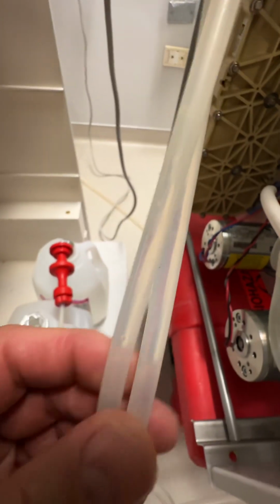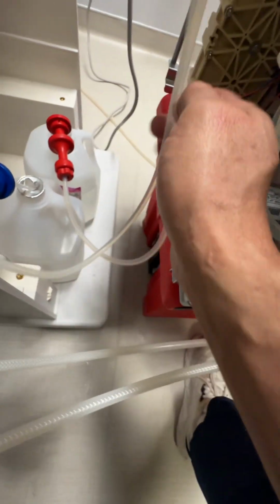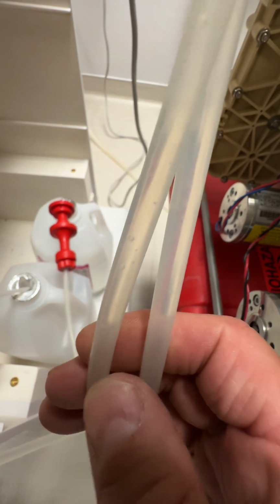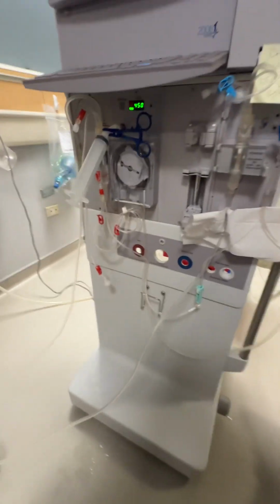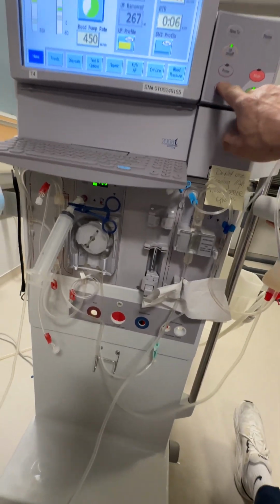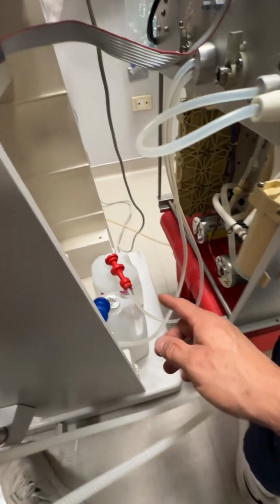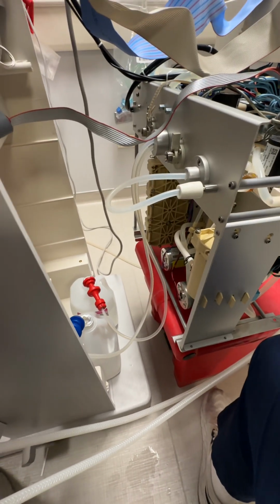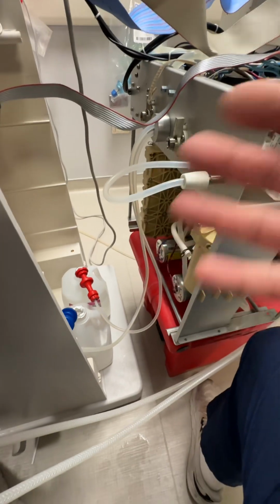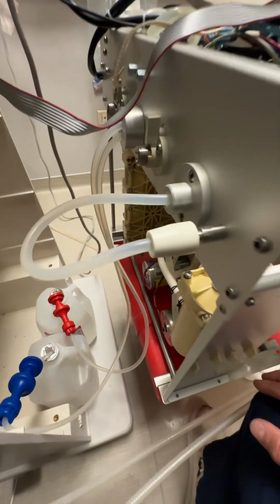If air gets into the machine, little air becomes big air. So you see acid and bicarb going up, but also in the acid and bicarb sometimes little air bubbles get sucked in. It's trying to take a blood pressure. There's no patient. So if we're sucking in air, little air gets sucked into the machine and it sees big air, and that's a high or low flow. It affects the flow of the machine. It sees something it shouldn't see.